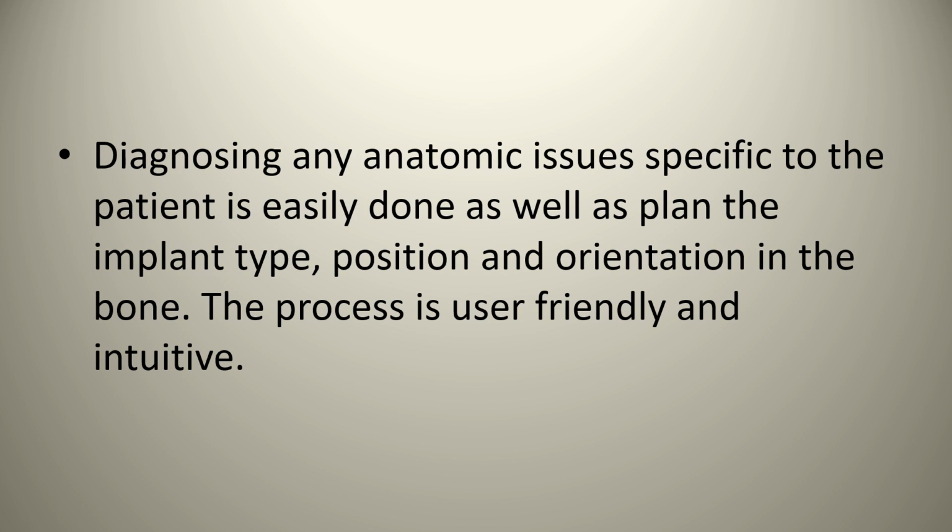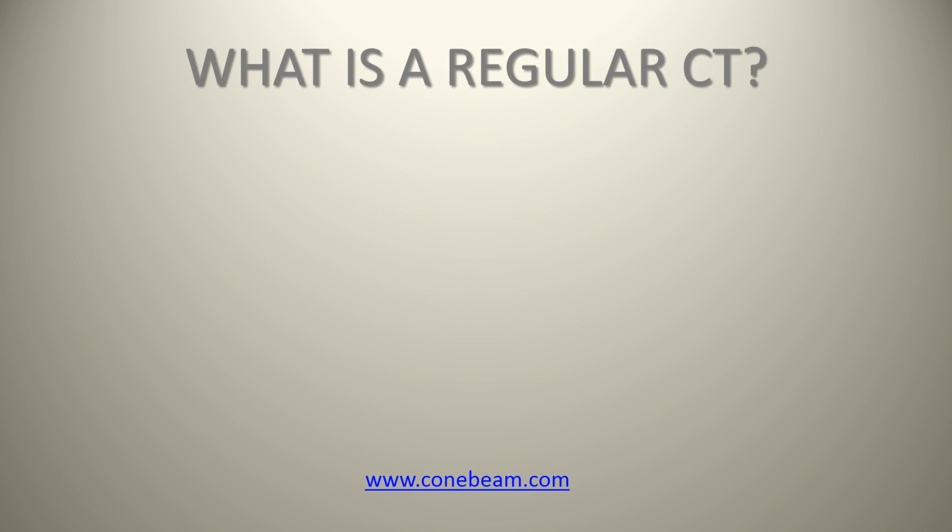So for those of you who may not necessarily stock a lot of implants inside your office and you're like, I don't know if I'm going to place a 10 millimeter, 11, or a 13. I'm not quite sure if I'm going to use a 3.7 platform or 4.2 or 4.5. With the CT scanner, you can pretty much know fairly accurately exactly which implant size you want to place, so that you don't have to sit there and order 6 implants, place 1, and have to return the other 5.